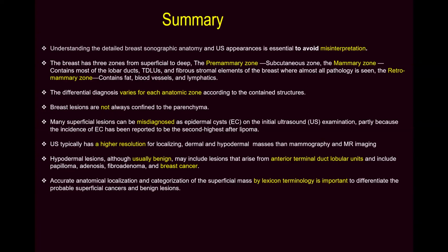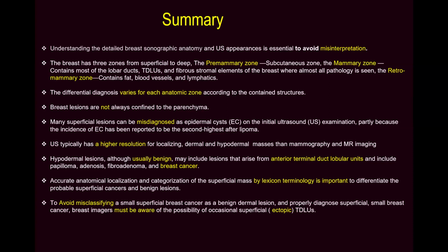Accurate anatomic localization and categorization of superficial masses by lexicon terminology is important to differentiate probable superficial cancers from benign lesions, to avoid misclassifying small superficial breast cancer as a benign dermal lesion, and to properly diagnose superficial small breast cancer.